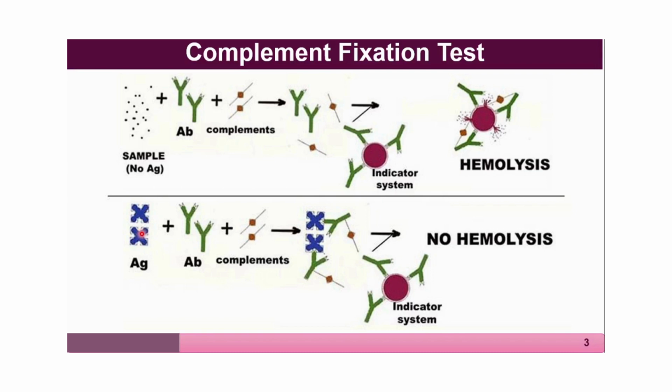It is in the soluble form. So antibody binds to it and engages that. To that now you add the complement containing serum. Since the antigen was already there in the test serum sample, the antibody added to it got engaged and bound to the antigens. It formed antigen-antibody complex.